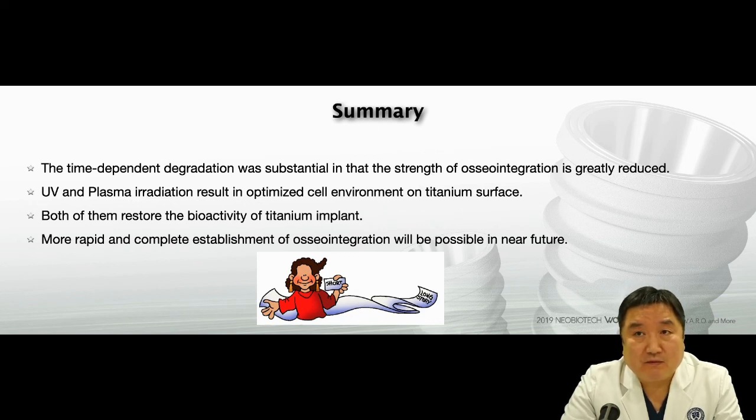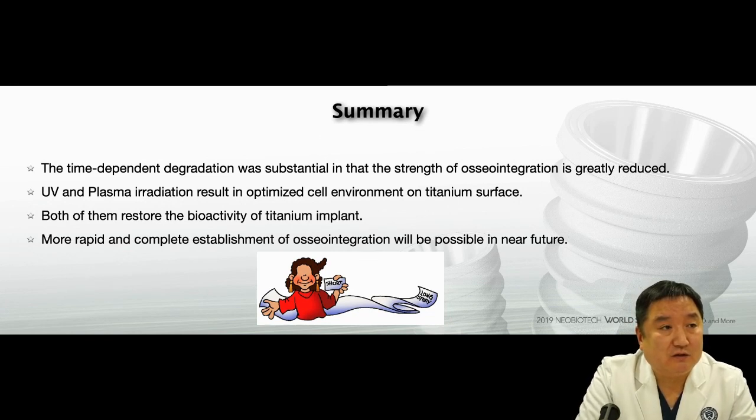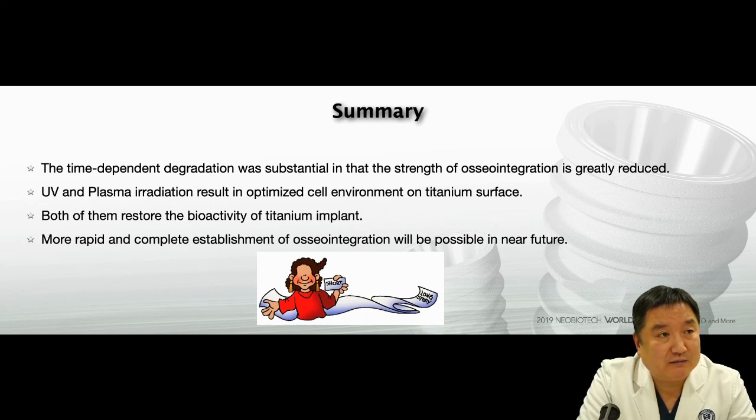Both of them restore the bioactivity of the titanium implant. So upon continuing research to improve surface functionalization devices, more rapid and complete establishment of osseointegration will be possible in the near future. I will be continuing my research in this area so that I will try to make a much shorter and much more effective device possible.